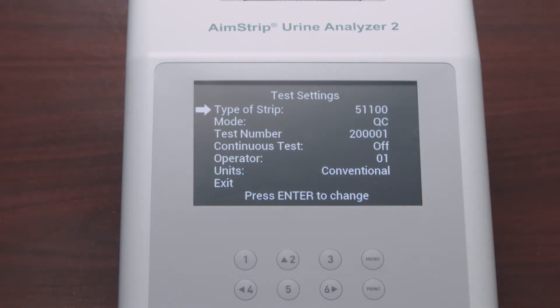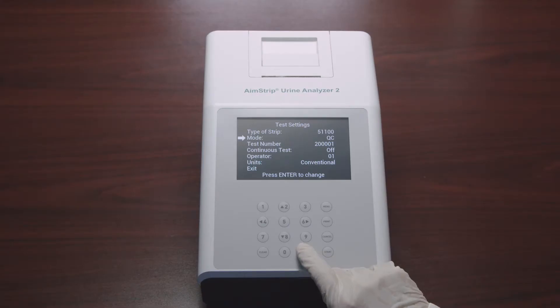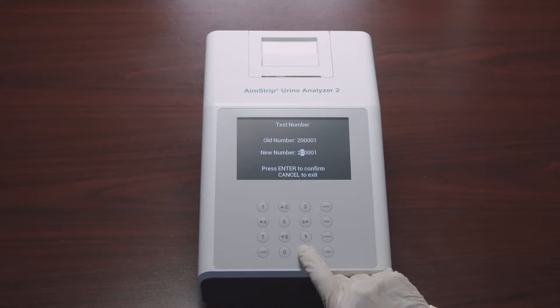Keep pressing Enter until the strip type matches the strips to be used — in this case, 10 parameters. After selecting the strip type, select Mode and press Enter to change it. There are three test mode options: Routine Test for normal urine testing, Stat Test for emergency urine testing, and QC Test for positive or negative controls. You can also select the test number and enter a new test number, then press Enter to confirm.